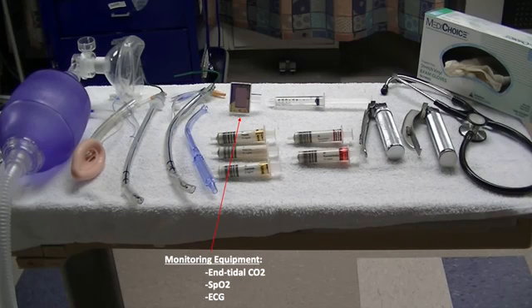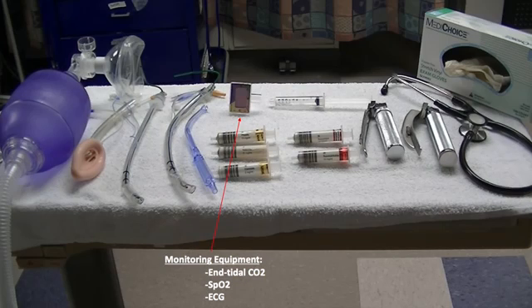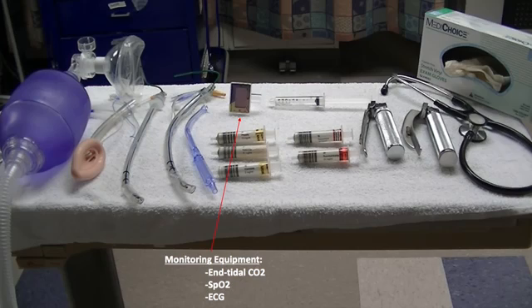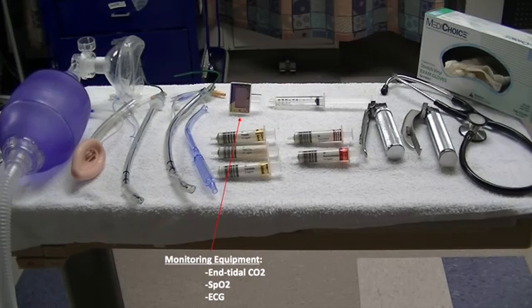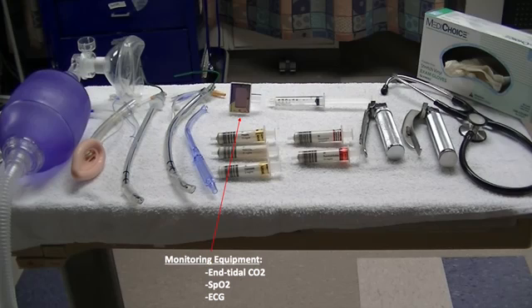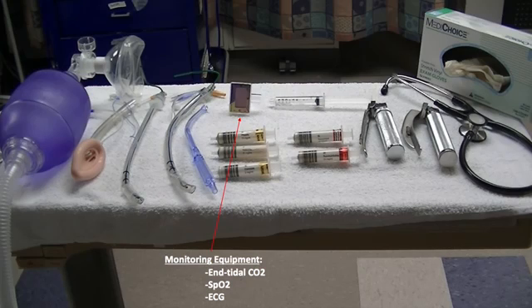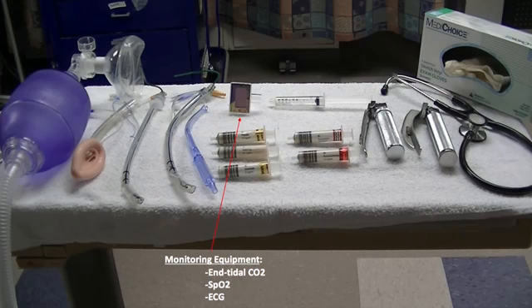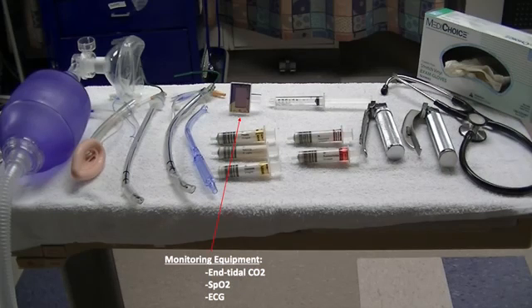One piece of monitoring equipment to remember is the end-tidal CO2, which will confirm successful intubation. What you see here is a color change device — a pH-sensitive chemical indicator that changes color from purple to yellow when exposed to CO2. This device connects to the endotracheal tube and will confirm placement of the ET tube in the airway.